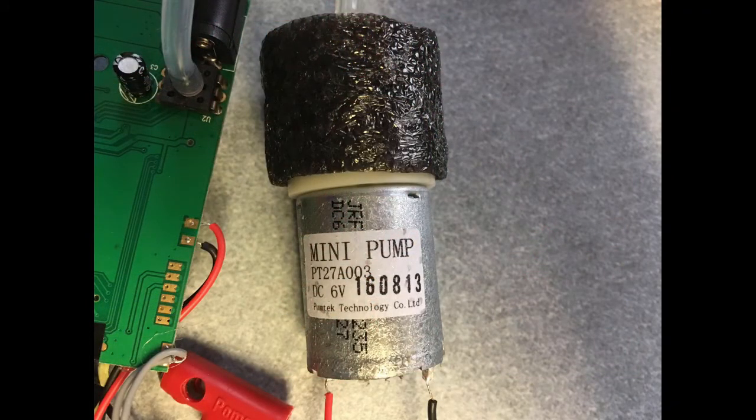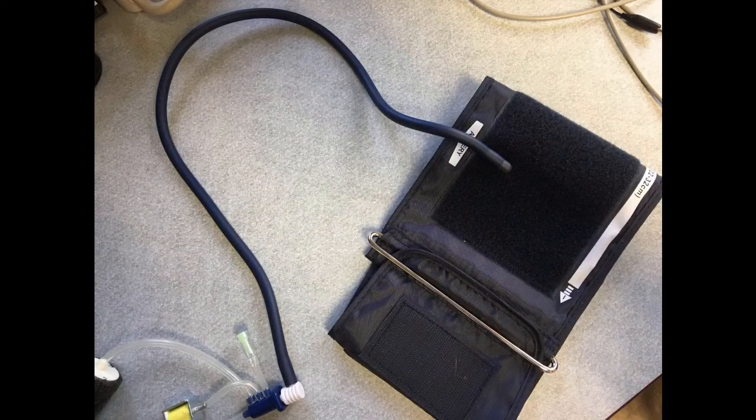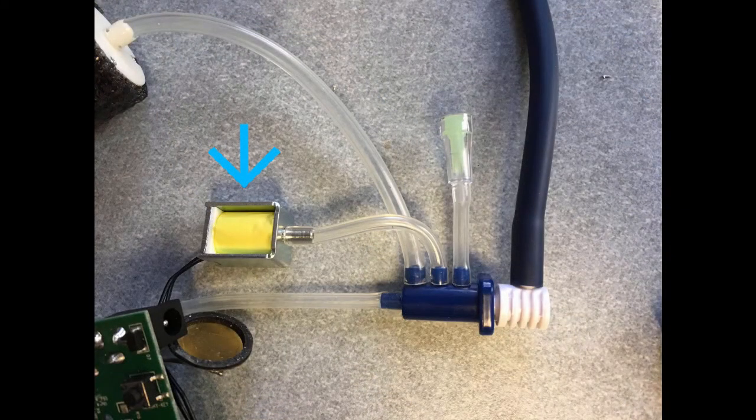Looking at each individual part of the blood pressure monitor: the air pump pushes air into the plastic tubing connected to the armband. The air moves to a junction, and a red-arrow-indicated emergency valve will release air in case the armband does not stop inflating. Air then moves into the cuff, which inflates until the sensor registers it as properly filled. A valve periodically releases air to slowly deflate the cuff — this is an always-open valve, which remains open as long as there is no electricity supplied, ensuring the cuff deflates in the event of a power loss.